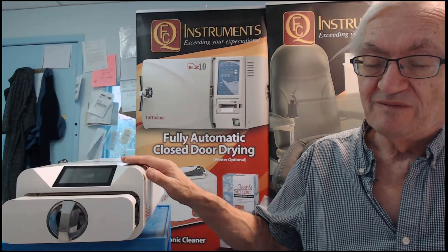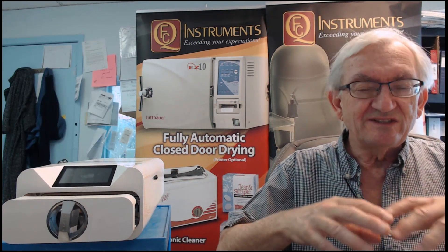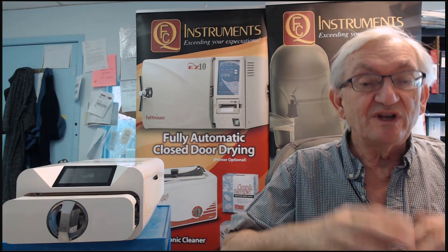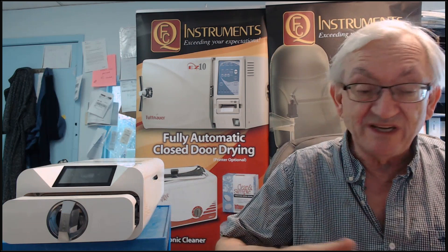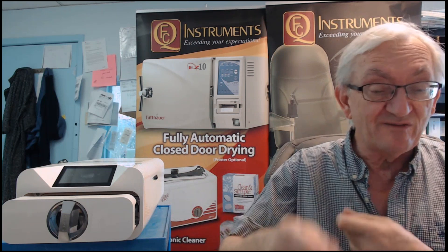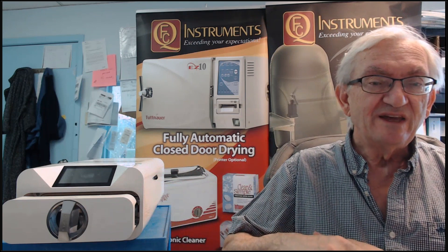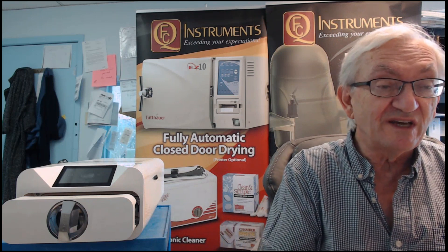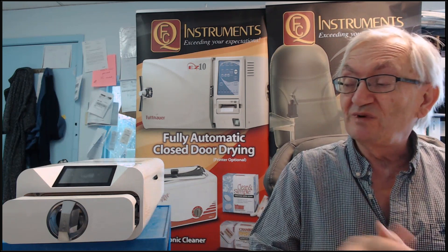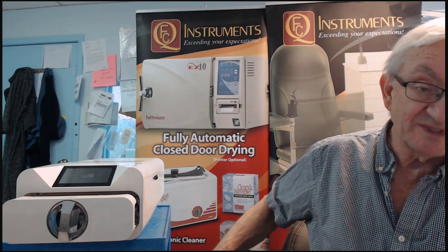The autoclave itself is portable. As a foot care person, could you autoclave as you go along? If the cycle completes in 15 minutes and your average treatment time is 20 minutes, could you stay ahead of the game? The answer is yes. It is portable — you could go offsite to use it. It doesn't require any special electrical, and you just take those bottles of distilled water.